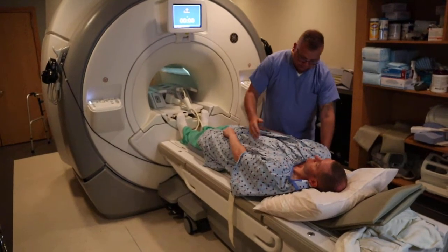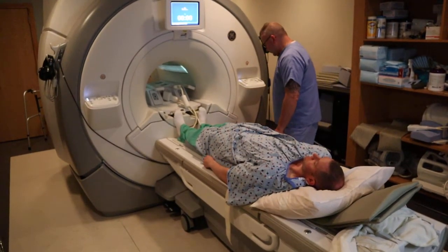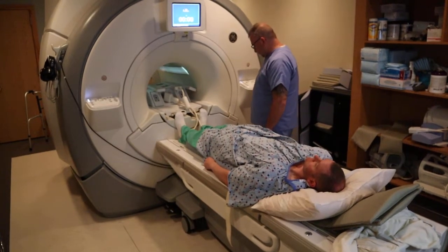The positioning for an abdomen normally is going to be three fingers below the xiphoid process.